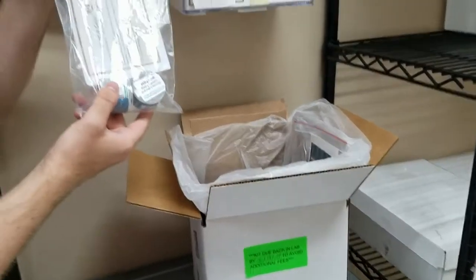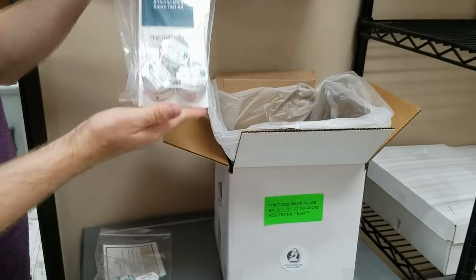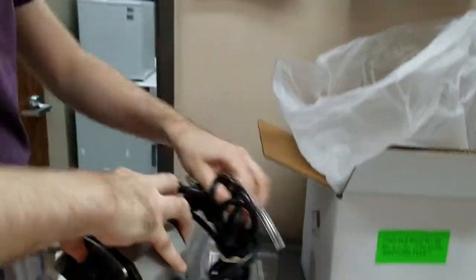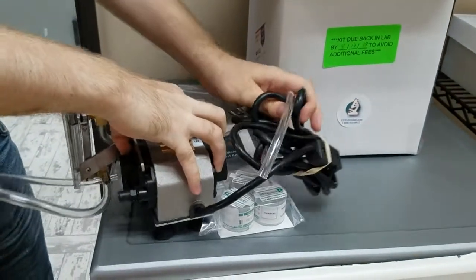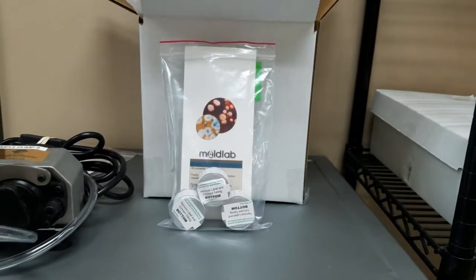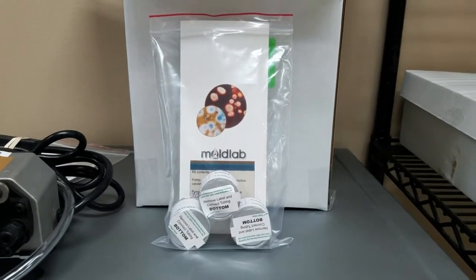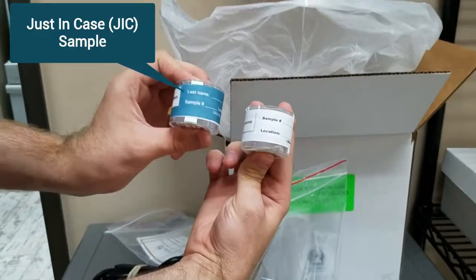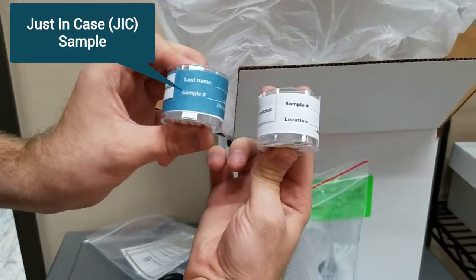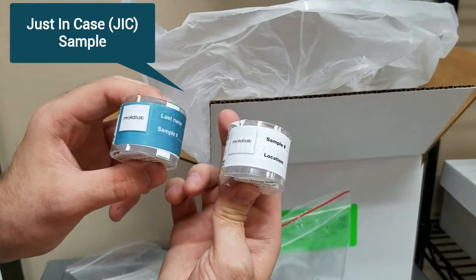The kit will have two extra just-in-case air cassettes, three sample collection cassettes, a pump, and a clear tubing. The three sample collection cassettes are what you'll use to collect your samples. It comes in a bag with our pamphlet. If you need more than three sample collection cassettes, we have included two just-in-case cassettes labeled with a blue sticker for an additional cost.